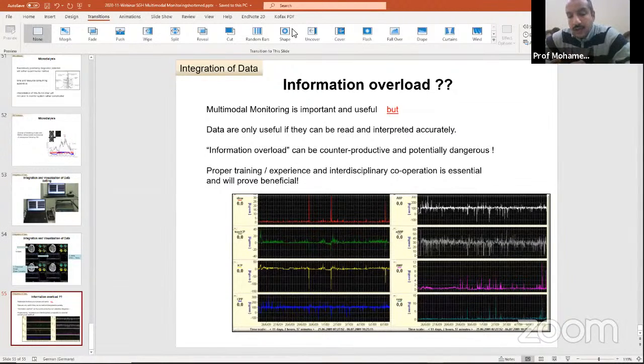For the measured intracranial pressure, it depends on the time of the examination. Usually it's done by the ICU team, the neurologist, or some neurosurgeons who are interested in measuring the transcranial Doppler. So you measure around 3 or 4 times per day. At that time only, you will detect that there is high ICP, but you don't know how long the patient was in that situation. It helps, but it's not practical for the minute-to-minute follow-up of these patients.